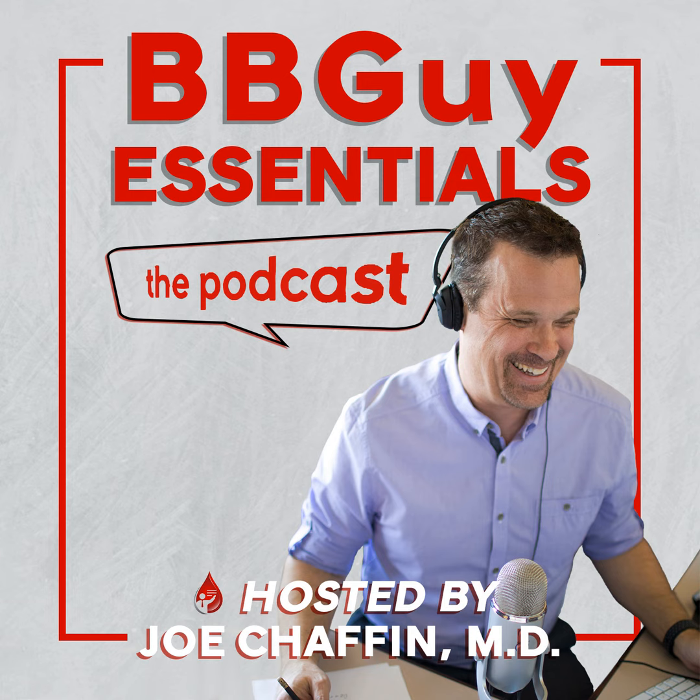This is my soapbox, Jill. I'm sorry. No, but I think you're right. In the end, blood transfusion is a medical decision. And I think that if we're in the lab, we don't have the ultimate responsibility in deciding whether the patient is transfused or not. That's quite a heavy responsibility for the treating clinician. And so we really need to take into account the emergency of the situation and understand, is it better to give incompatible blood at this point, or can the clinician really wait to see if this patient can actually cope?